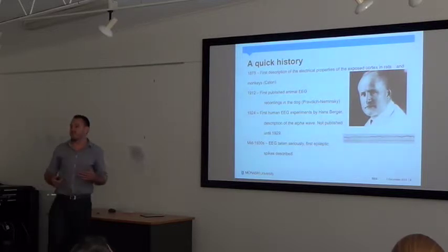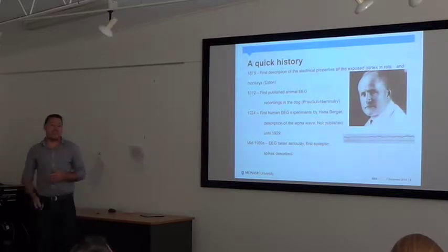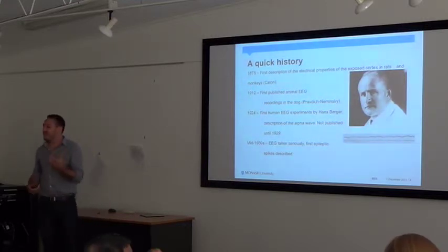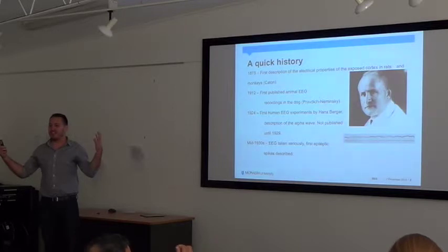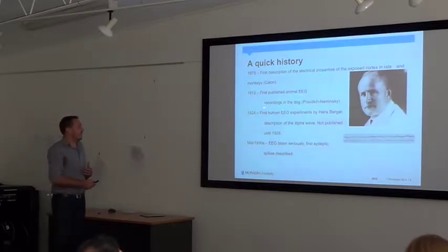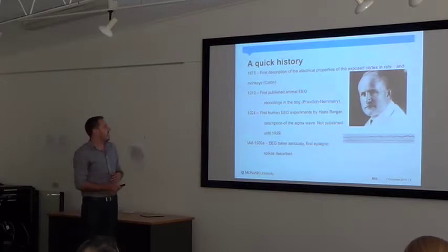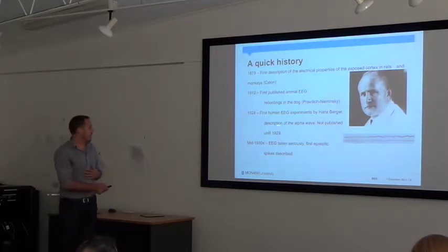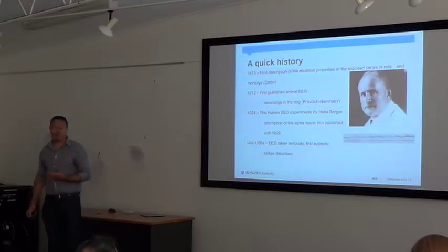So he became very interested in the idea of telepathy. And so the whole idea of EEG was actually trying to measure how two brains could communicate without having any physical connection. So he did his first recordings in around 1924 and saw what's now commonly known as the alpha wave. So this is a brain wave here, and this is just a sine wave down the bottom. But he wasn't really convinced himself, funnily enough. And it took him about 5 years to actually publish these results.